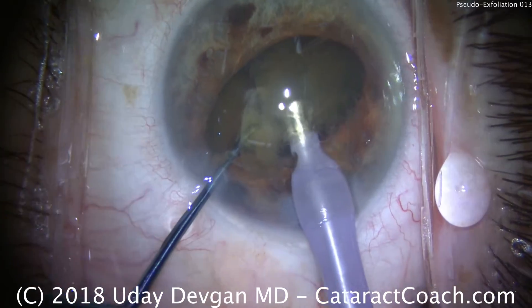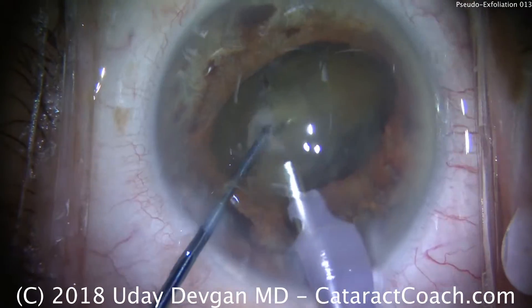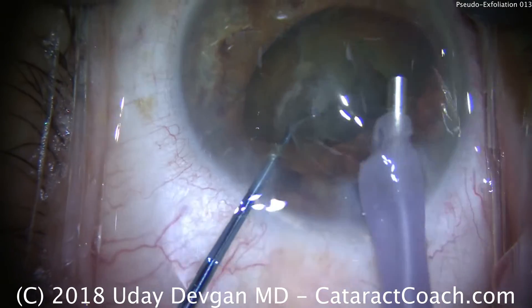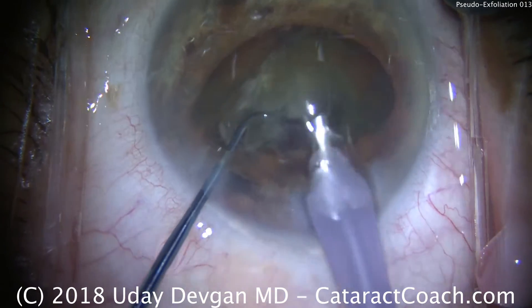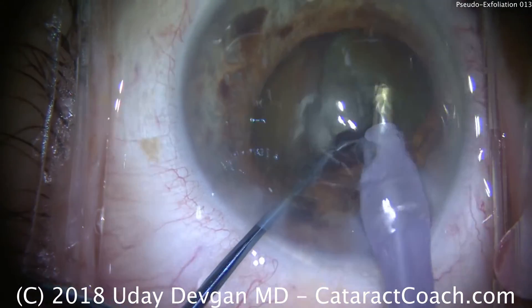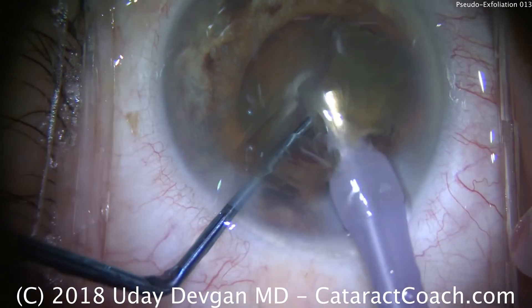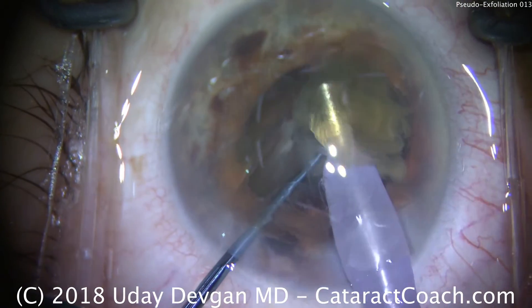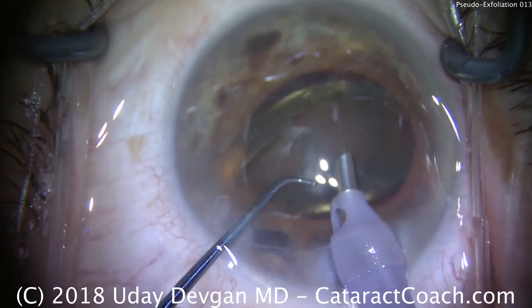We can now get the first half and start to apply phaco energy to emulsify and remove it. We're also going to further sub-chop it. The anterior chamber's a little on the shallow side, so we want to work at the iris plane if we can. We're emulsifying one half of the nucleus — about a quarter gone, and here's the remaining quarter. Remember to use phaco power modulations here to minimize energy. Half the nucleus is out.